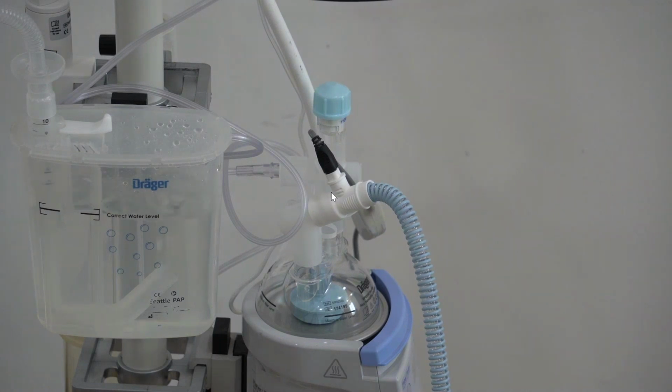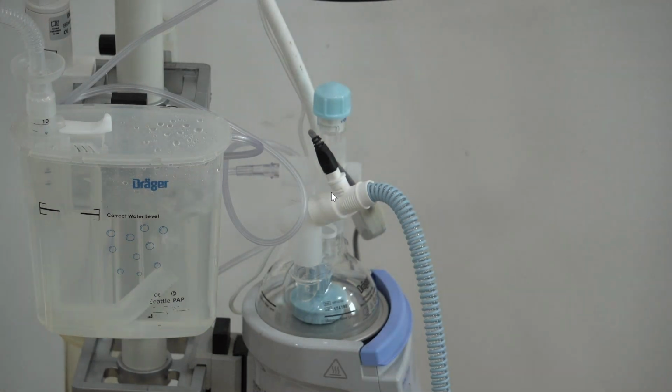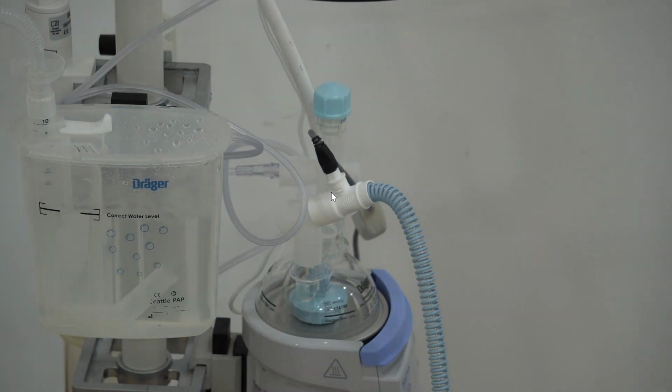Okay, so that is a very good question. Why is the CPAP shown on the Dräger ventilator as PEEP? That is indeed a good question, and this is basically the nomenclature. At the end of the day, CPAP is the therapy name, continuous positive airway pressure ventilation.